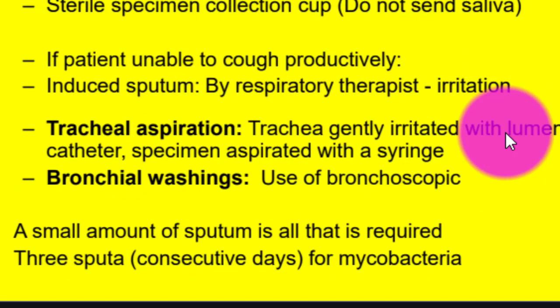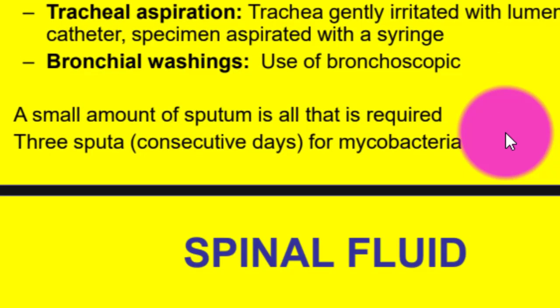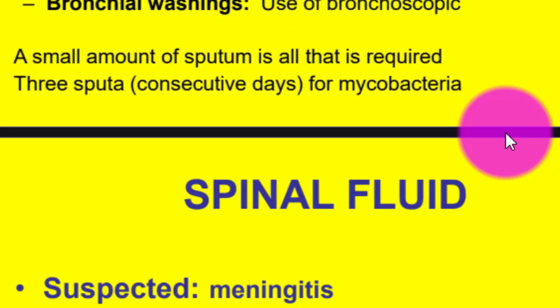Sputum, suspected lower respiratory tract infection, pneumonia or tuberculosis. Rinse the mouth with water or saline, not mouthwash. Encourage a deep cough with expectoration of the sputum. Sterile specimen collection. If the patient is unable to cough productively, induce sputum by a respiratory therapist. Irritation, tracheal aspiration.